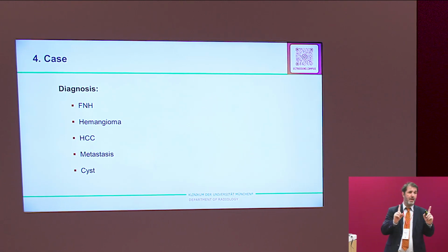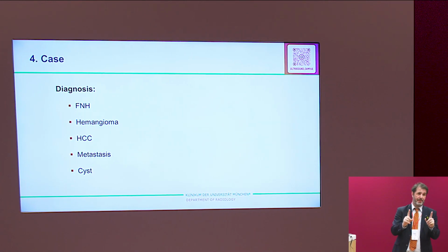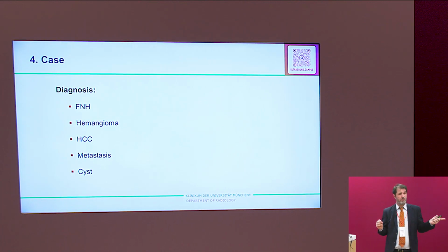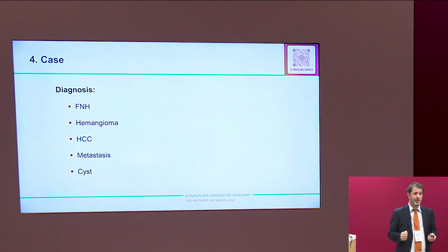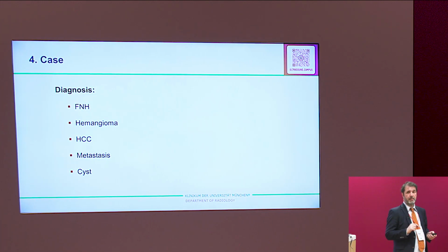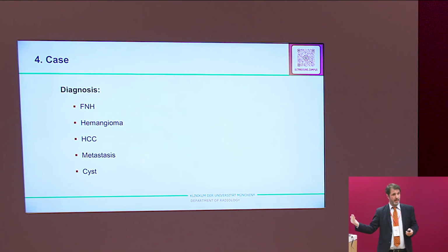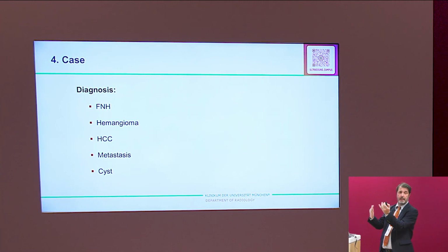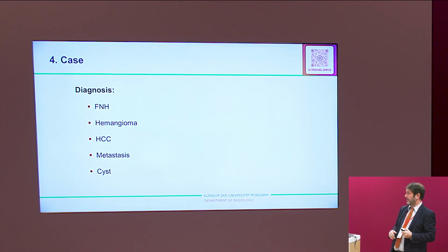But you see, the plane, that's important, matches perfectly. And sometimes it's very tricky to find tiny lesions which they describe in the CT, a sub-centimeter lesion, to tell us what kind of lesion it is. Then you have to scan half an hour to find this lesion, and at the end of your examination, they say, are you sure that you have seen the correct lesion? But by fusion, you know exactly what the target lesion is, and the other doctor, who sent the patient to you, sees, okay, he has really done this lesion and nothing else.